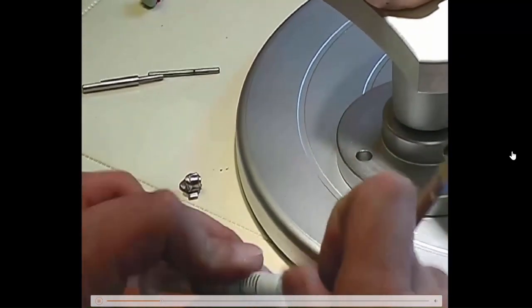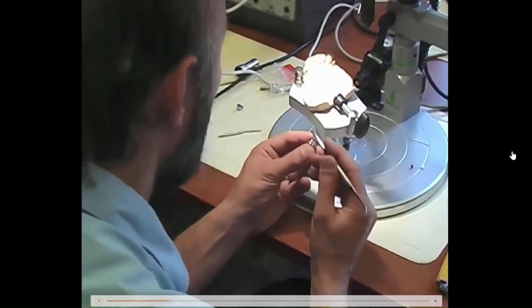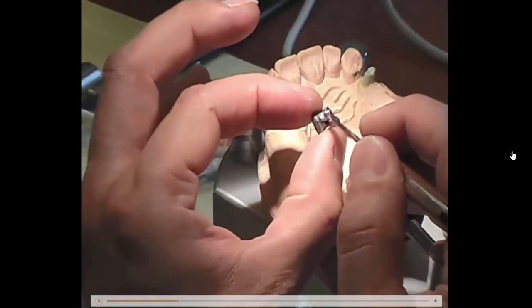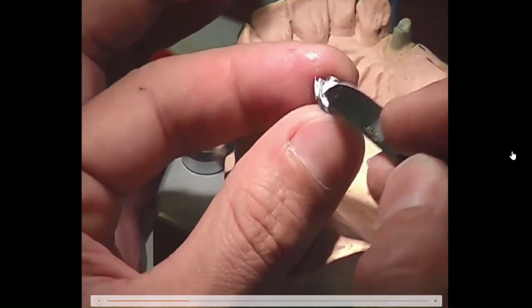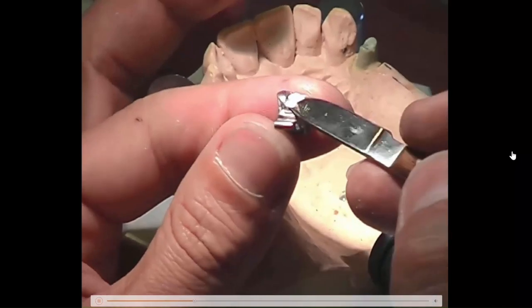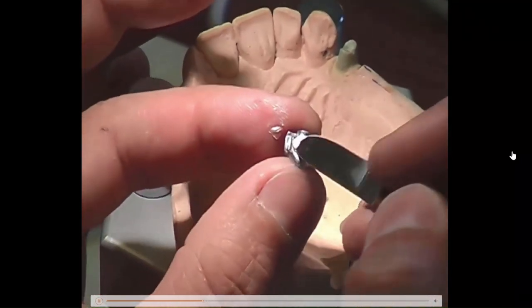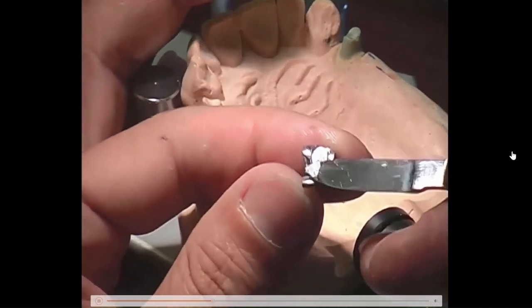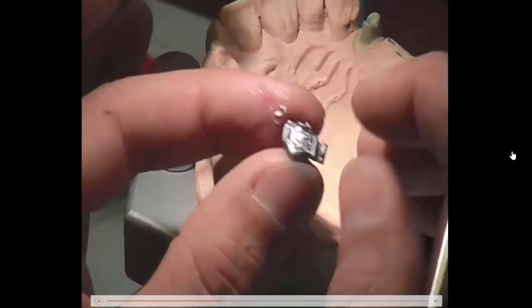That's the parallelometer. And we apply this paste, diamond paste, on the milled surfaces. Yeah, it doesn't have to be much. I don't need to have too much of it, but it has to be there in order to be able to slowly, diamond against metal, trim one part to the other part.